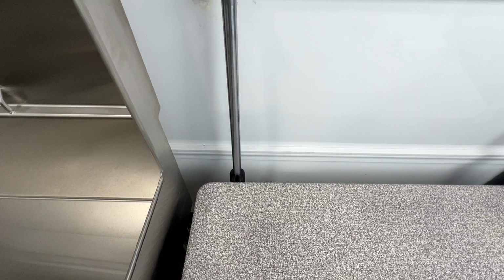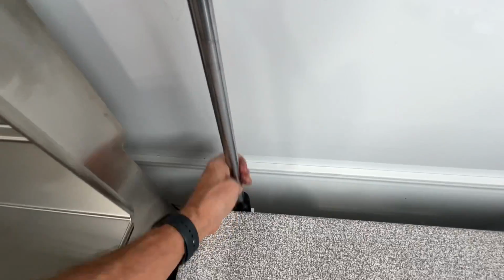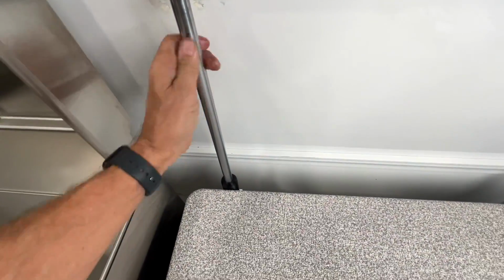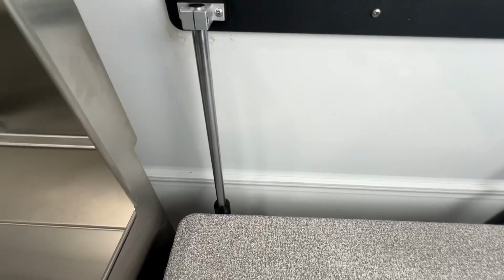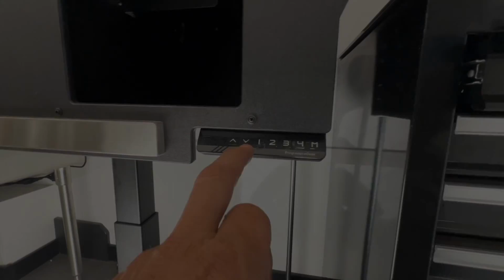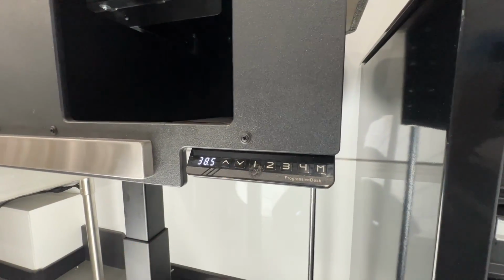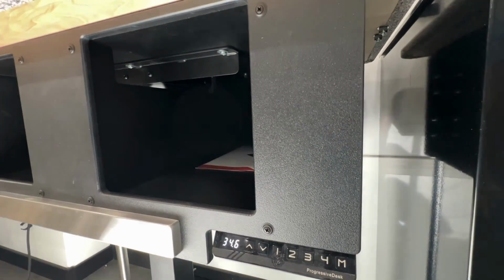Now lower the table to number 1, and we're going to take what residue we do have on your fingers and wipe it all over the upper parts of the rail. Keeping this a very, very thin film. Do not let it get thick. Now raise and lower the table from 1 to 4, 3 or 4 times. This will assure that the grease gets evenly distributed within the bearing.